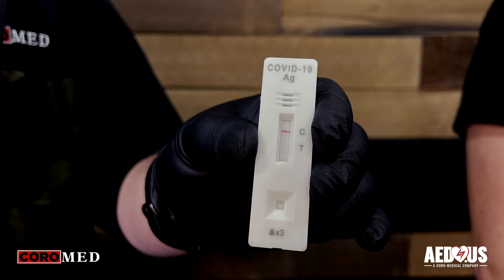All right, so we have our results and as you can see here on the cassette, only one red colored line appeared next to the C, indicating a negative result for COVID.